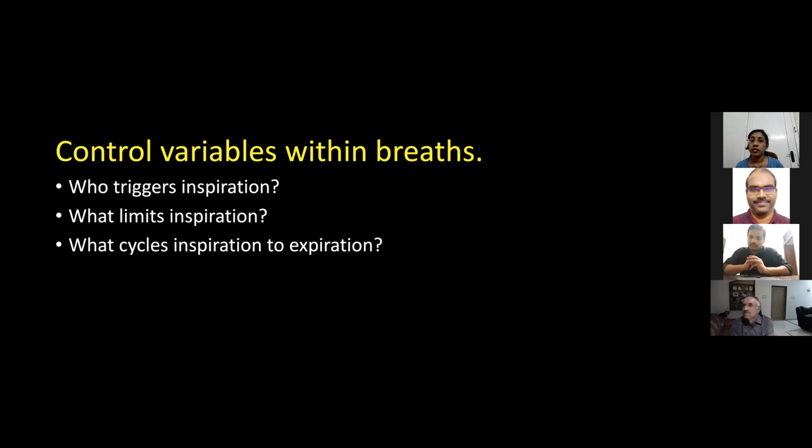Flow limit and pressure limit. What are the 2 limits for the inspiratory flow you can set on a ventilator? We did discuss that, isn't it? See, a ventilator produces only inspiratory flow and you can set only 2 limits. What are the 2 limits? Volume and pressure, isn't it? Yes. This we have already discussed. So one part of the question is already answered.